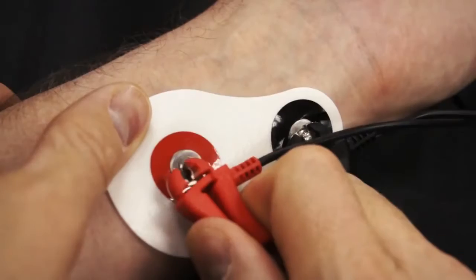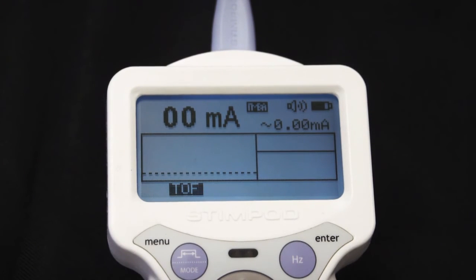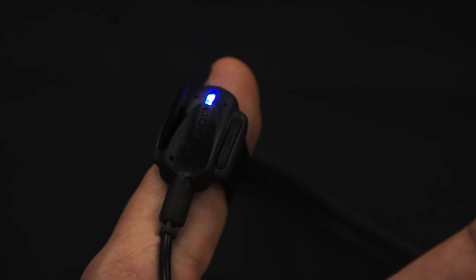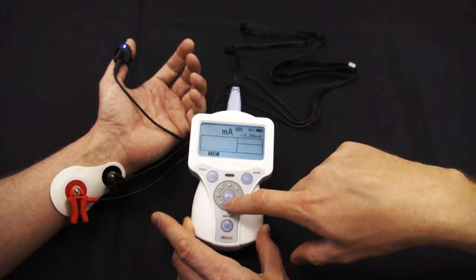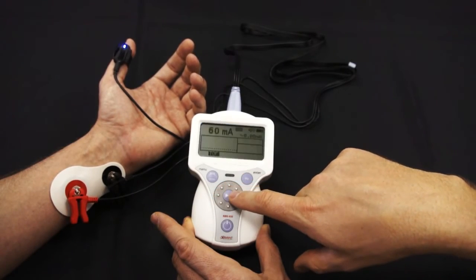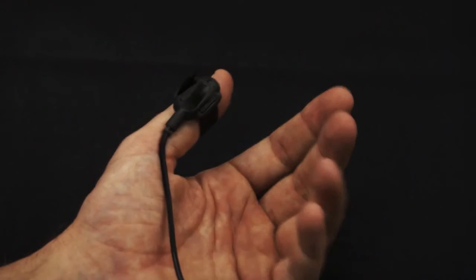Step 3: Set up electrodes on the patient. The open circuit screen alert will disappear, meaning the unit is now ready to stimulate the nerve. Step 4: Attach the accelerometer to the patient's thumb. Step 5: Adjust the current by touching the adjustment wheel, pressing enter to confirm, then circling the wheel until the desired current is reached. Step 6: Stimulate the nerve by pressing the play button.